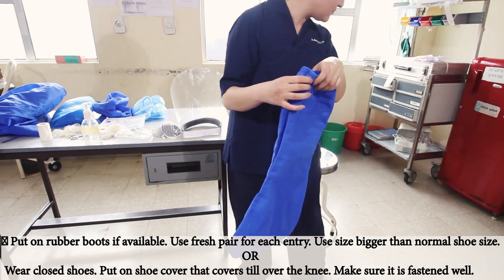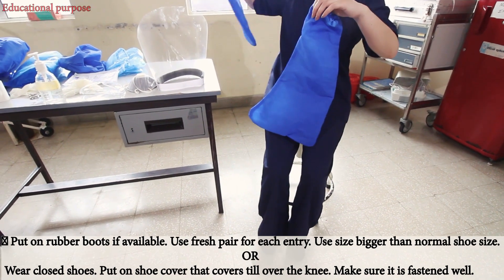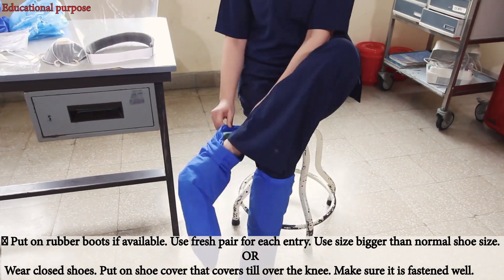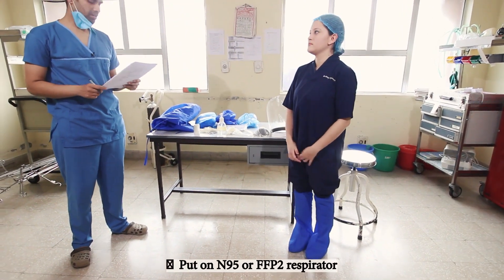Put on rubber boots if available; if not, wear closed shoes. Put on the shoe cover — that is a knee-length high cover — and make sure it is fastened well. After the shoe cover, we will put on the respirator.